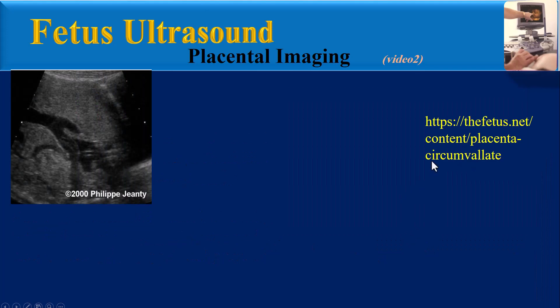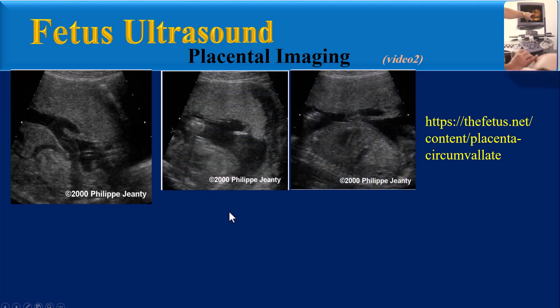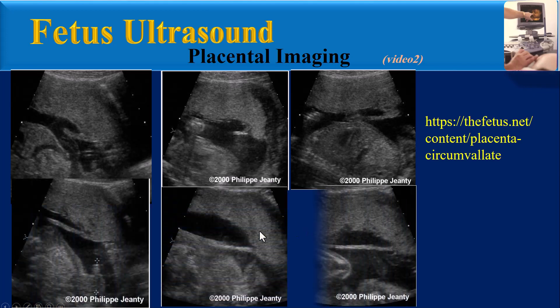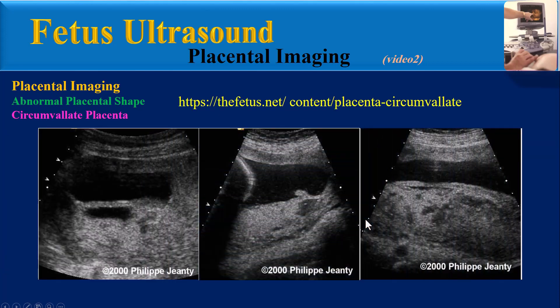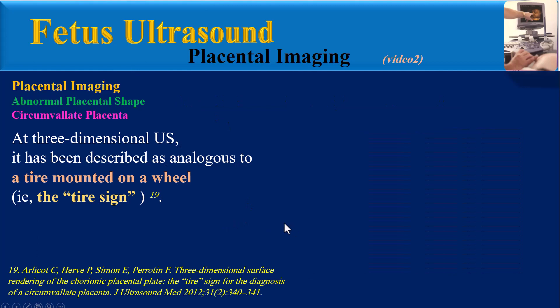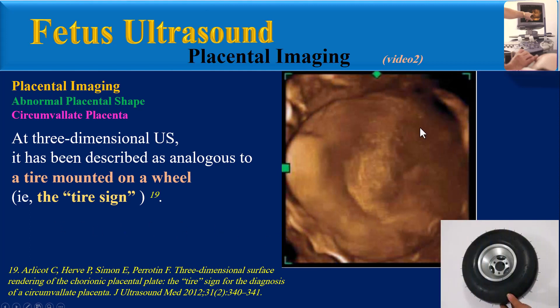This photograph shows the double-back fold in the membranes at their attachment near the margins of the placental fetal surface. These images, taken from the fetus.net website presented by Professor Felipe Jeanty, show different views of circumvallate placenta in multiple cases. At three-dimensional ultrasound, circumvallate placenta has been described as analogous to a tire mounted on a wheel — the 'tire sign.' A 3D surface rendering of the placenta shows a circumferential depression with a thick peripheral ring on the chorion plate.